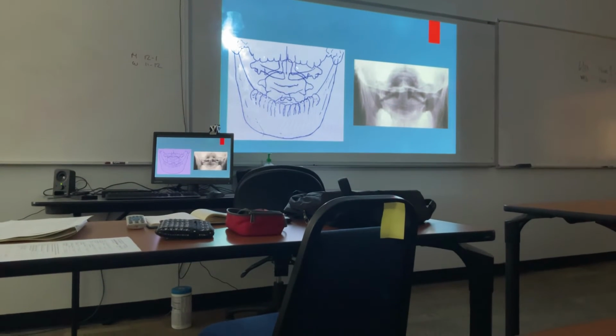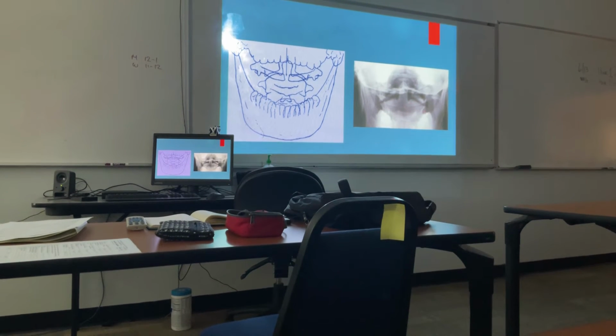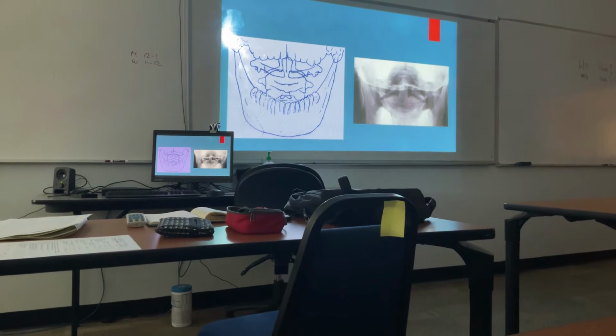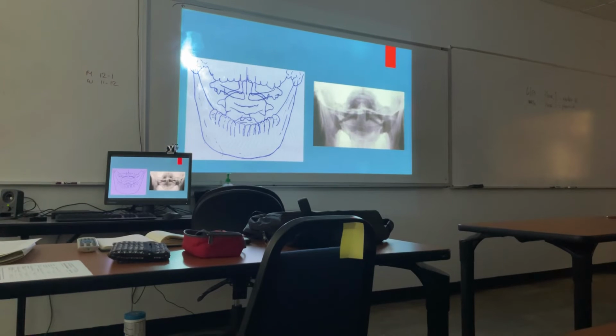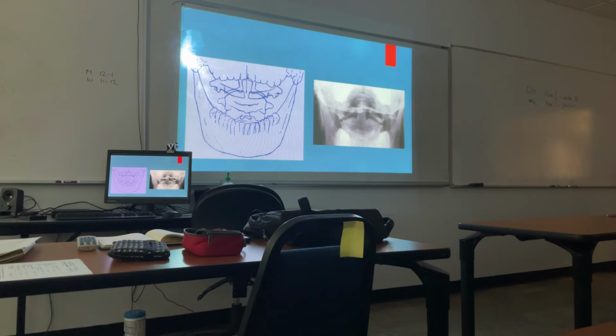It's easy to see on the cartoon diagram, but it can be small, medium, or large. I'll show you examples where this much of it is missing. Okay, 3 cases I've collected where this much of the posterior neural arch is missing, and the red is normal. In the one case he ended up playing high school football. You don't want to let somebody who doesn't have a posterior neural arch play football. Okay, red is normal. When it's your turn, so this would be gone to the urgent care center, negative report comes back, the parents assume that that's factual, that's accurate.